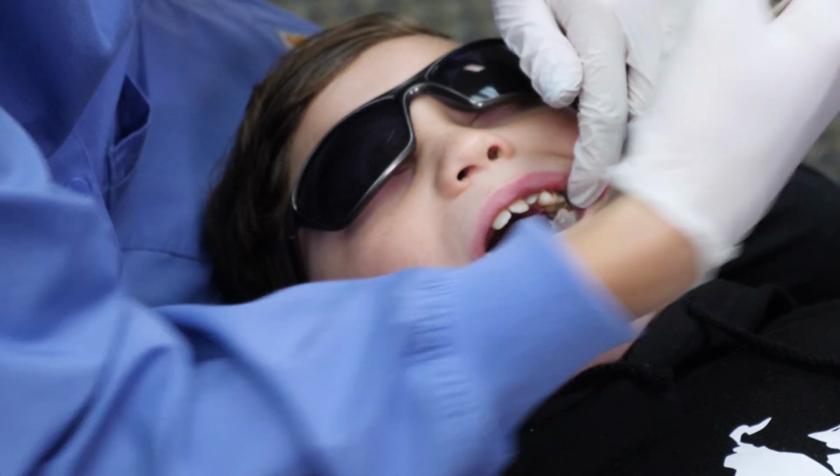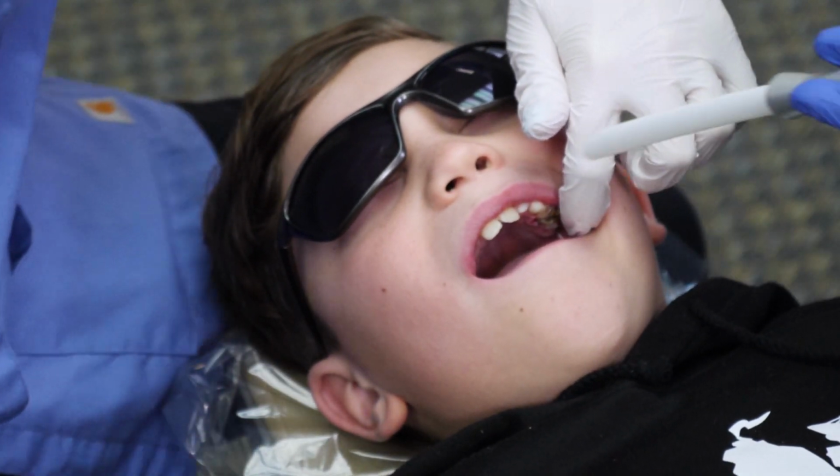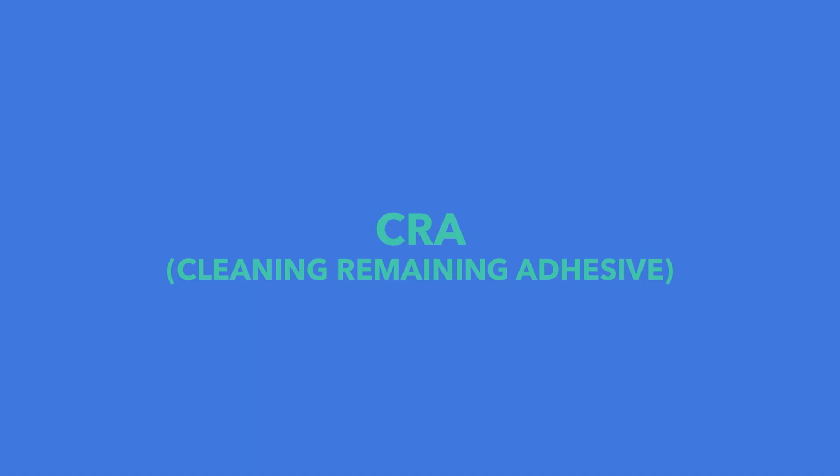Sometimes we'll have some gingivitis or swelling of the gums during the 8 or 12 weeks that they have it on, which clears up in a few days after the expander is removed.